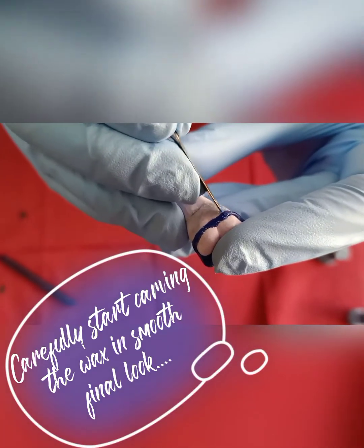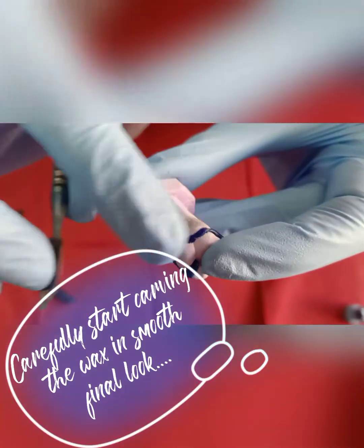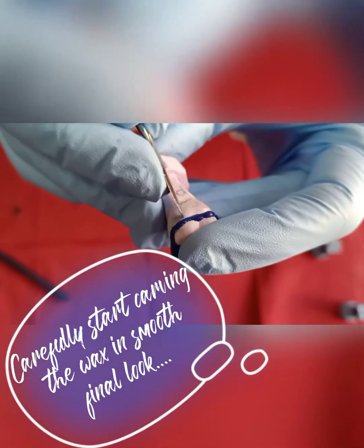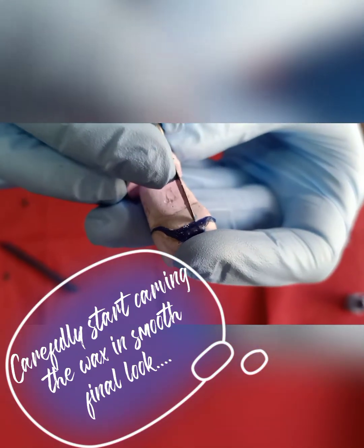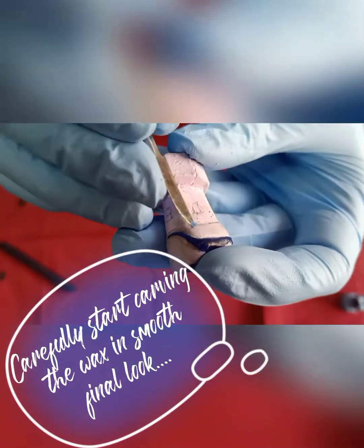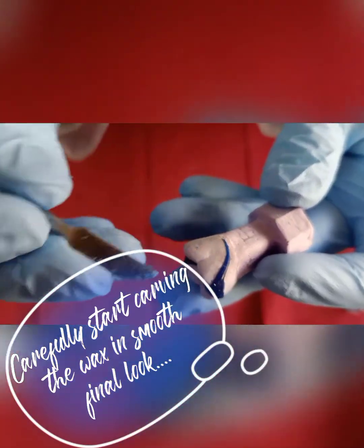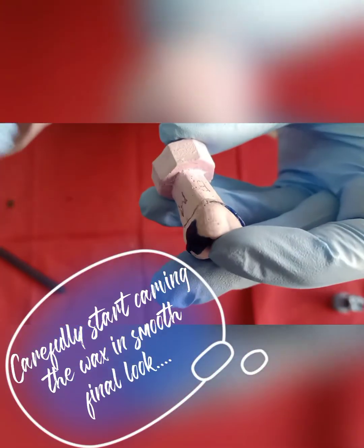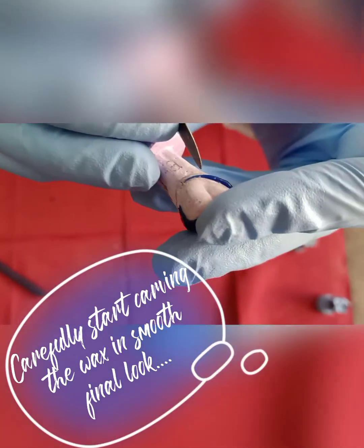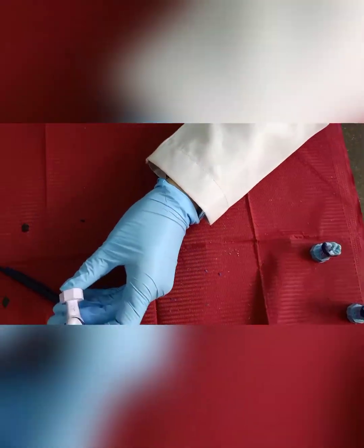Try to imagine that this wax is going to be metal, so it has to be smooth and confined to its place. No irregularities, no air bubbles, half rounded in cross section. The retentive arm should be tapered. The bracing arm should have a uniform thickness.